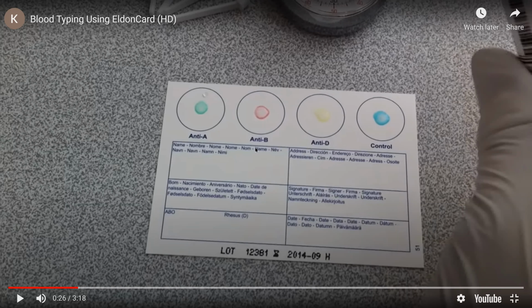All right, so I'm going to talk you through this blood typing kit that someone is demonstrating here on YouTube, just to hammer home how we determine this blood type. So what you can see here is the solution with the antibodies for anti-A, anti-B, anti-D, and the control have already been applied. They clearly put coloring in them so you can tell them apart, and they are now dissolved in that solution. So if you add blood to them, they will show that agglutination or clumping if those applicable sugar tags are present in the blood that is being applied.